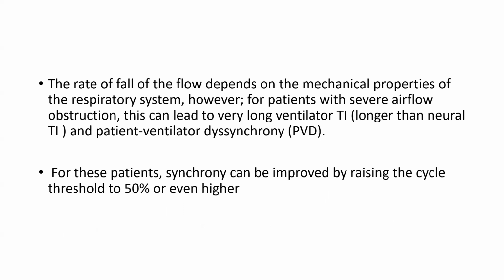The rate of fall of the flow depends upon the mechanical properties of the respiratory system. However, for patients with severe airway obstruction, this can lead to very long inspiratory times and patient-ventilator dyssynchrony. For these patients, synchrony can be improved by raising the cycle threshold to 50% or even higher.